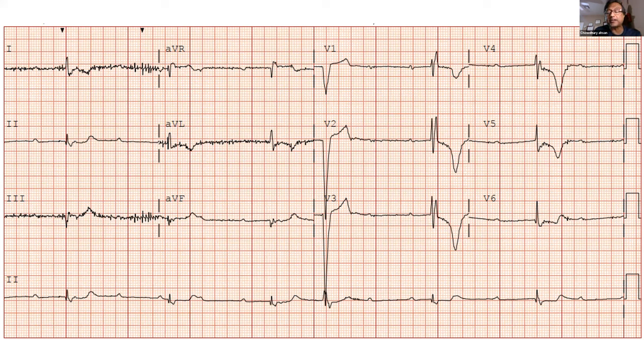Let me tell you a few other things. So the way I look at this EKG, is it tachycardia or bradycardia? This is significant bradycardia, and the bradycardia is denoted by the RR interval, and the RR interval is regular, but if you map the PP interval, also regular. So PP interval gives you atrial rate, and then RR interval gives you the ventricular rate.